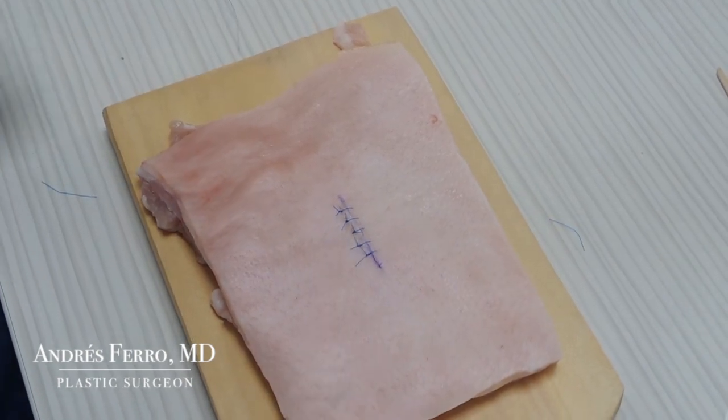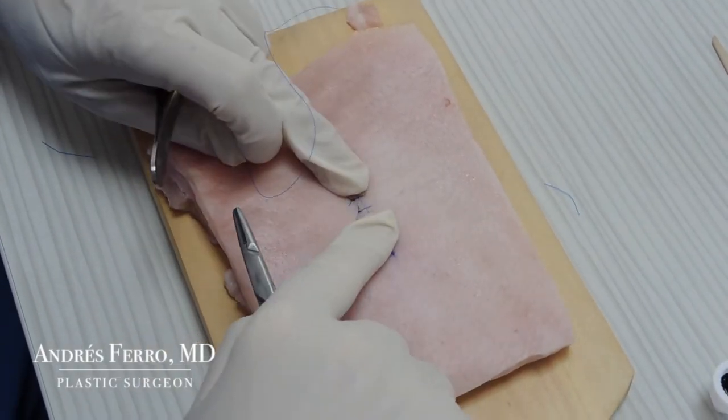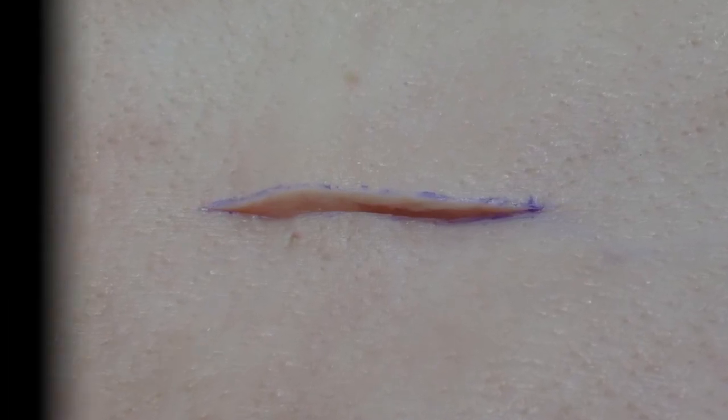We have concluded the wound's closure, and the leveling of it has been achieved. This is how the wound initially looked.